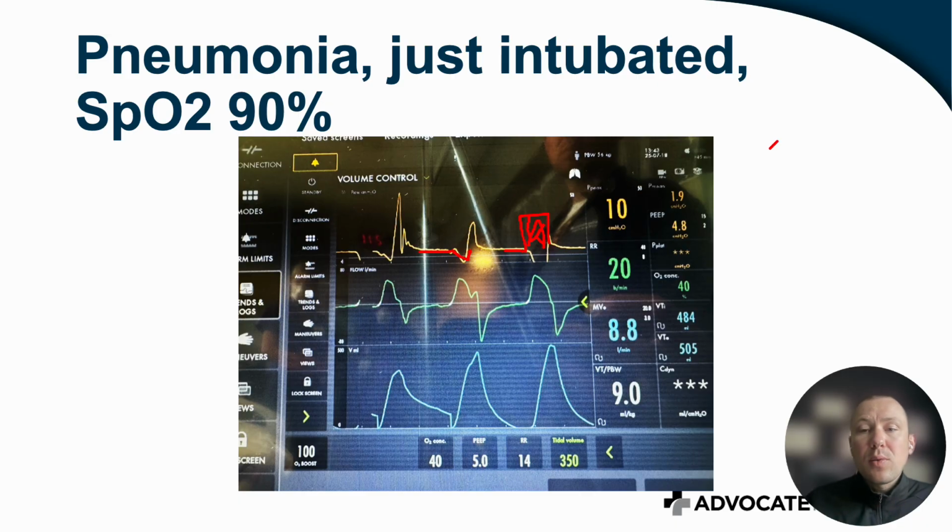So if our goal for this particular day is safety, which it was for my patient, then the next step would be to sedate patient or perhaps even paralyze them. But on the other hand, if your goal for this patient is comfort, then the adjustment of the mode to the pressure-based mechanical ventilation could be appropriate in this scenario.